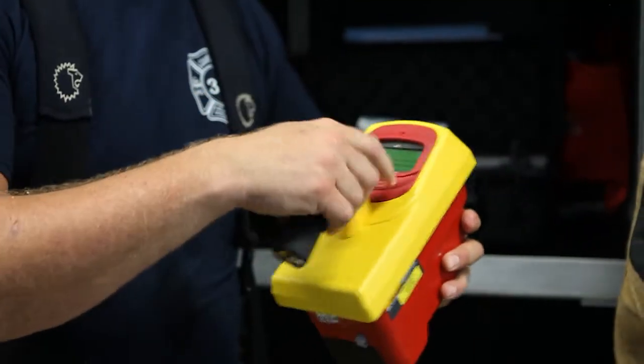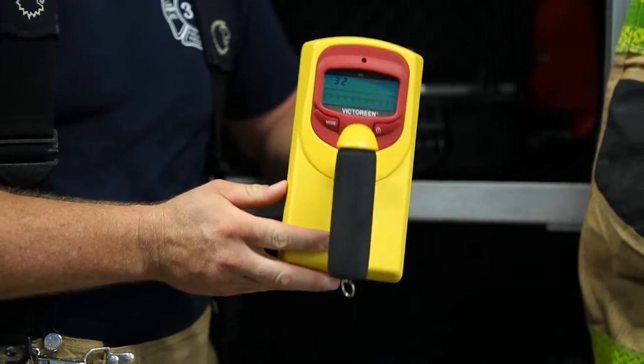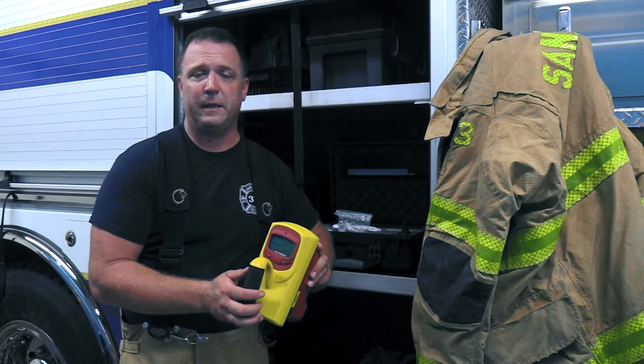For instance, when we power on the 451P, we know that we have to turn it on and wait for the device to stabilize. Also, we can't save the data onto the 451P.